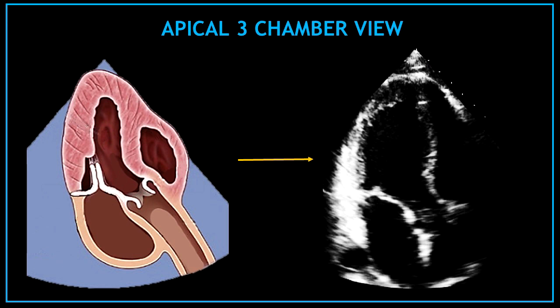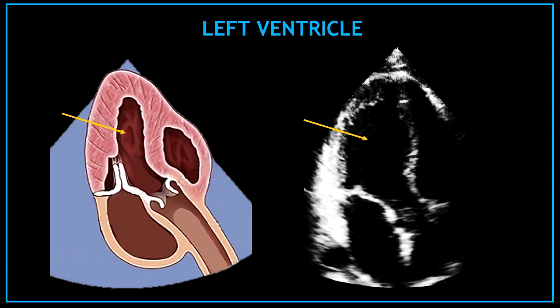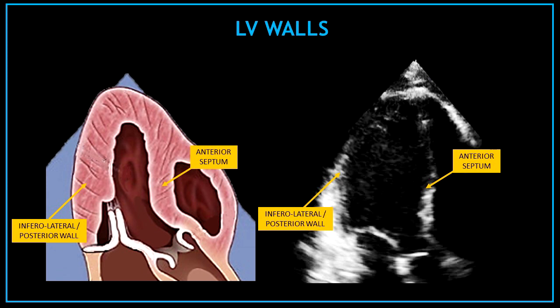And to finalize, this is the apical 3 chamber view, and I'm going to show you all the structures visualized here. The apical 3 chamber view is very similar to the parasternal long axis view. Let's start with the left ventricle, which is that big chamber at the top of your screen. The left ventricular walls visualized in this view are the inferolateral or posterior wall on your left hand side and the anterior septum in the middle of the screen.